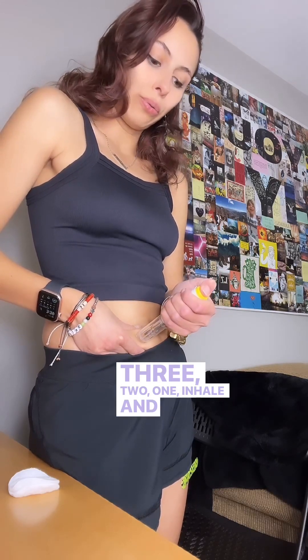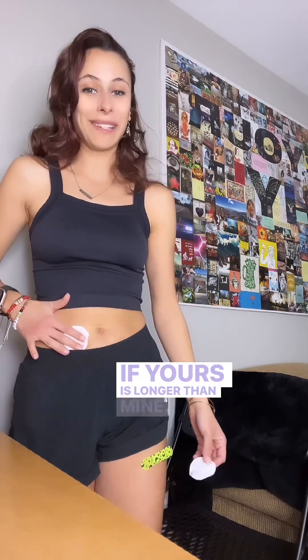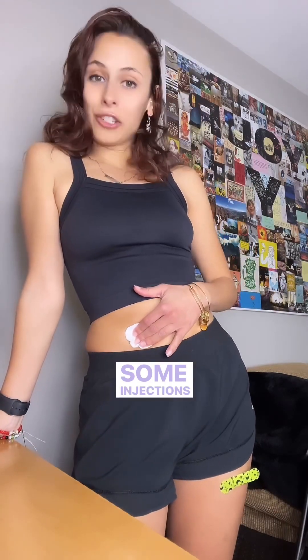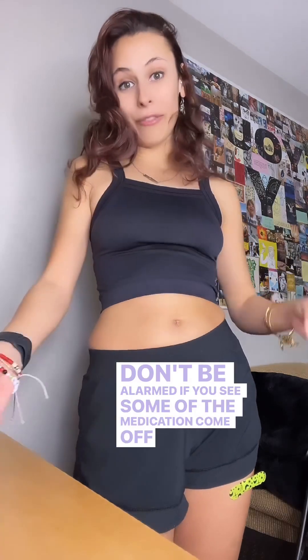Keep going if yours is longer than mine. And then when you're done, put the pad on and apply some pressure right there. Some injections will sting — sometimes the sting is harder than the needle itself. Don't be alarmed if you see some of the medication come off onto your cotton pad. Then put your band-aid on and you're done.